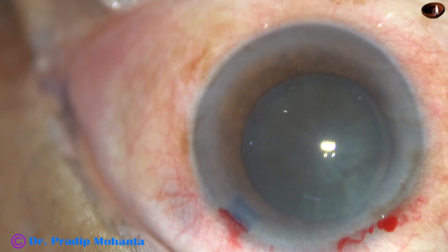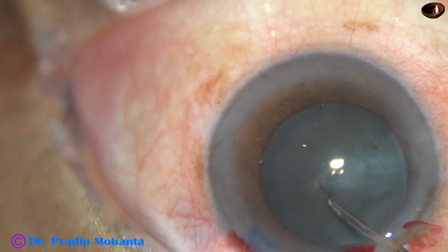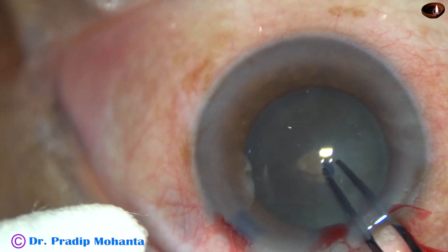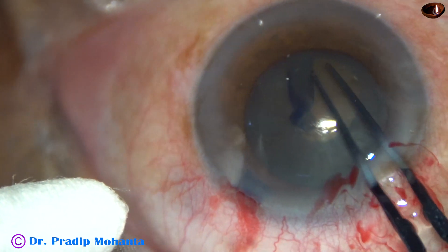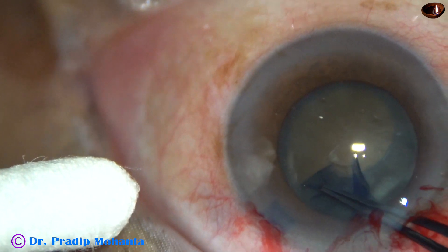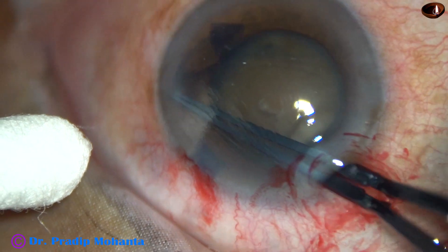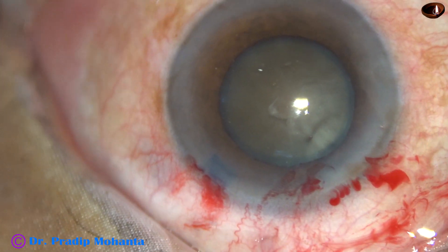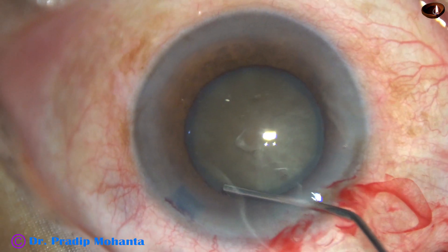Visco has been injected again. See the rhexis — the anterior capsule has been incised and a capsular tag has been raised. Very nice capsular tag. I hold this tag with utrata, go anti-clockwise almost along the border of the pupil. And thus I have got an adequate-sized rhexis of about 5.5 to 5.75 millimeter. Since this cataract is hard, I needed a rhexis of this size.